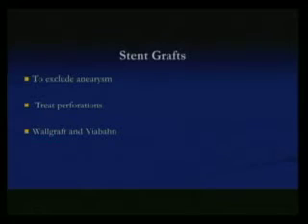It's a covered stent graft. So Wallgraft and Viabahn are the two stent grafts that I use. And recently, the company Gore has come up with a balloon expandable Viabahn kind of, VBX also. And Dr. Rao used it today in the left common iliac.